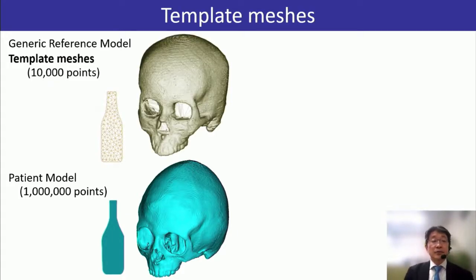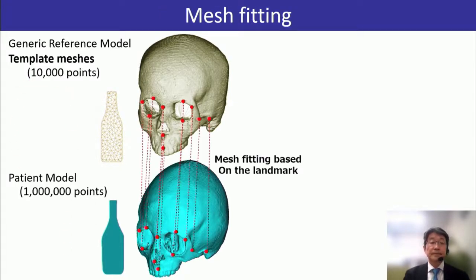In order to reduce the size, we prepared a template mesh with 10,000 points. And using the reference points, this template is fitted to the patient models.